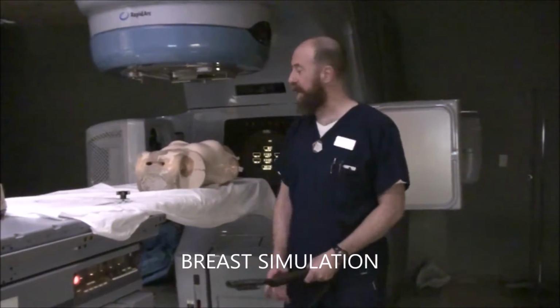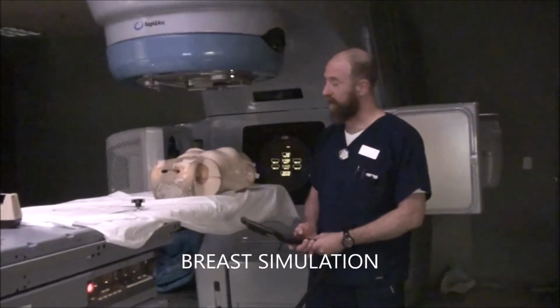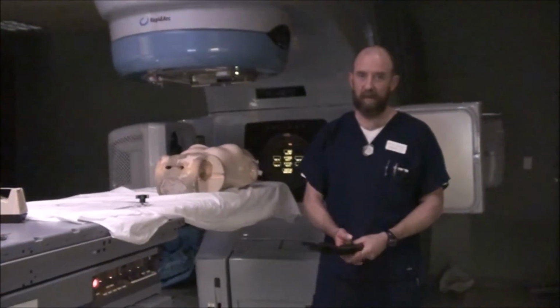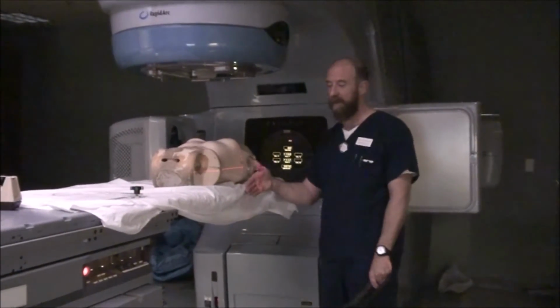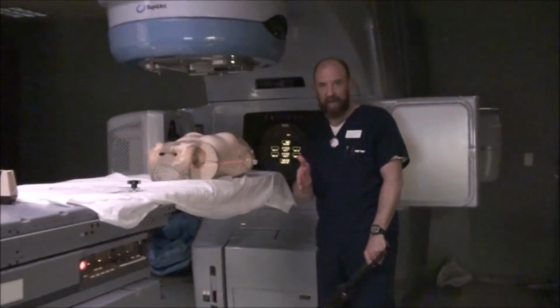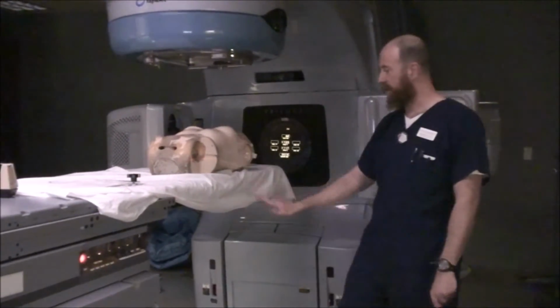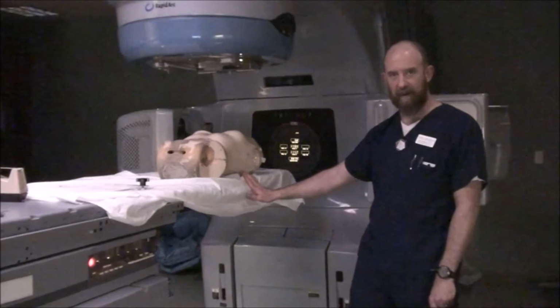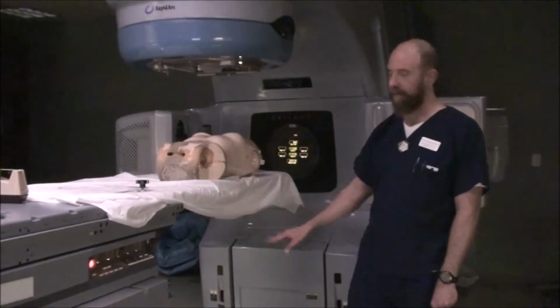We're going to show you this week how to simulate a breast the old way. Initially, when you're doing these, just like when you treat them, have the patient on the side of the table that you're treating. So if it's a left breast, left side of the table. We want to be able to clear the table with all of our readings and not have to treat through the table or take films through the table.